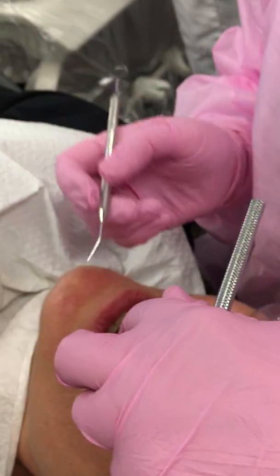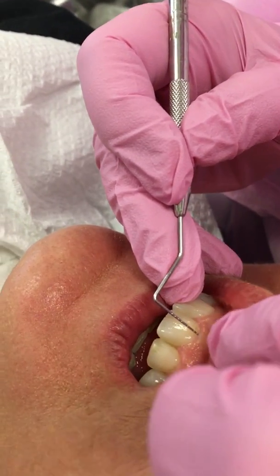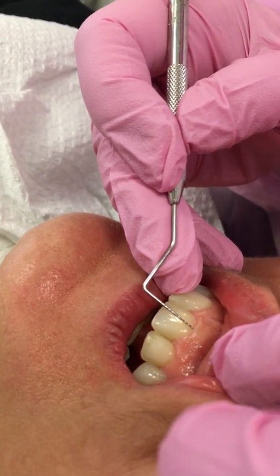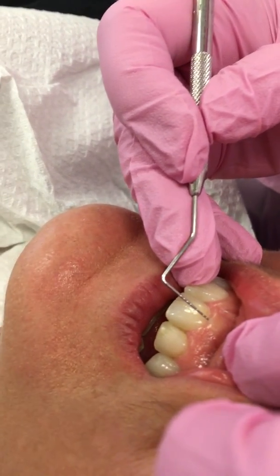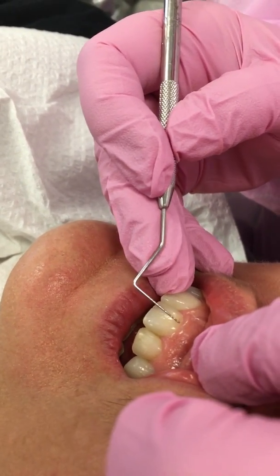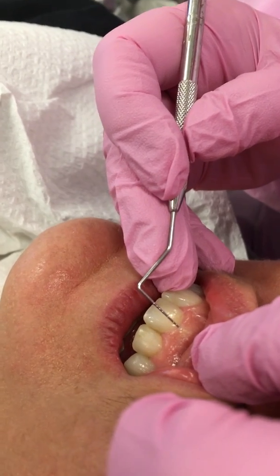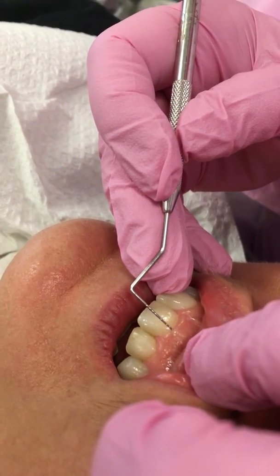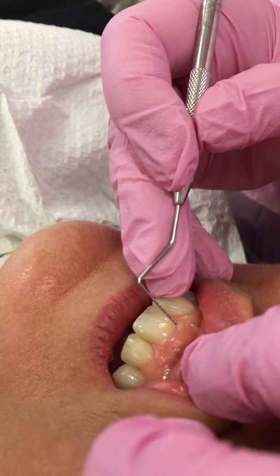All right, so if I put my probe in, it stops. You can see it. It stops right there at where that indentation or that free gingival groove was. Okay? And so I know about where it's supposed to stop because I can see that groove. All right? Okay?